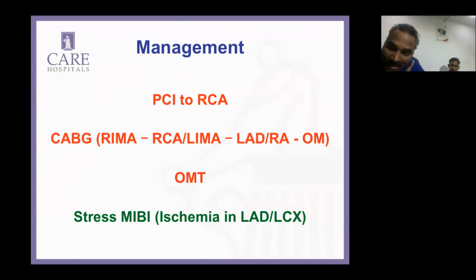Next, come to RAO and put your catheter anteriorly in the left sinus, give a second injection. And if you still don't see it, take a catheter into the right sinus, put it anterior in RAO and give another injection and see. This is how you have to fish your left system. If we can follow this method, you may end up making it out. We need not send the patient to Johan sir.